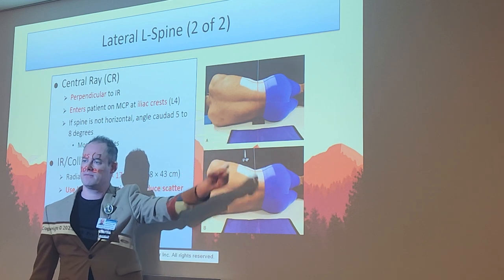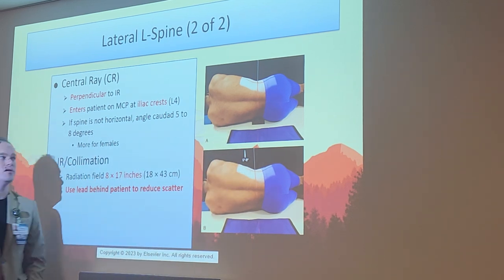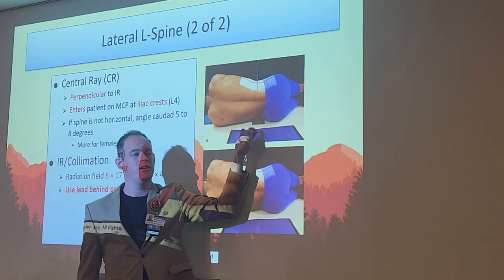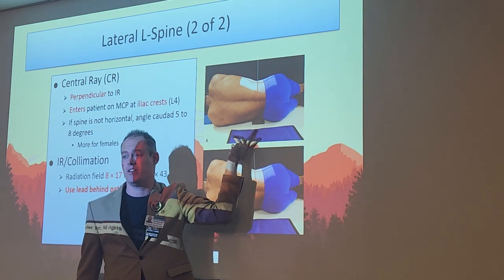Does it have to be a sponge, or can we use sheets? I wouldn't use sheets, because think about what you're doing. Look how your ray is going through the body. Sheets are going to be picked up. It's going to be a big, nasty artifact on your film. You would want it to be a radiolucent sponge, which, let's be honest, most facilities do not have.